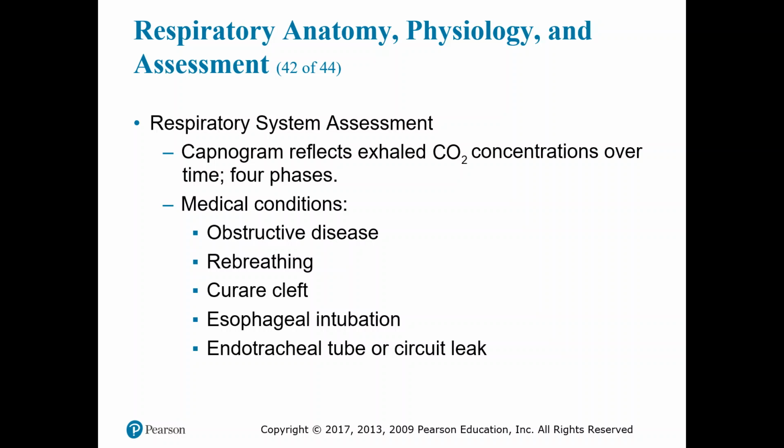Hyperventilation leads to elimination of CO2 and progressively lowered exhaled CO2 levels. So hyperventilation is going to start dropping your end tidal CO2 measurement. Like I said, I've demonstrated this in class before where I've hyperventilated myself and dropped my end tidal CO2 down to 22, the lowest I've been able to get it. It took me about 2 to 3 hours to recover from that, and I strongly do not recommend it.